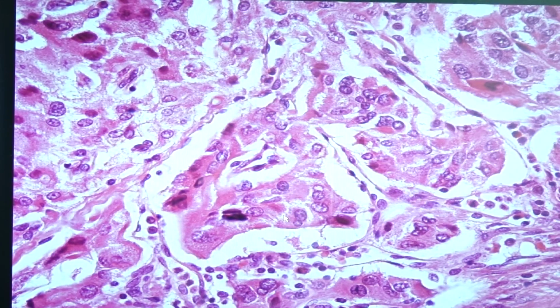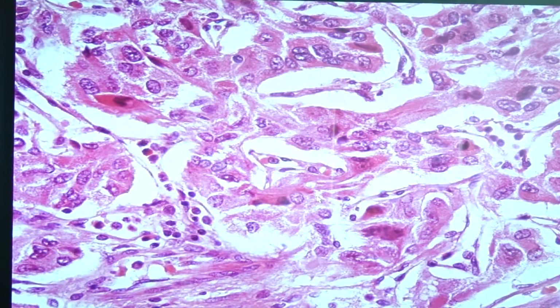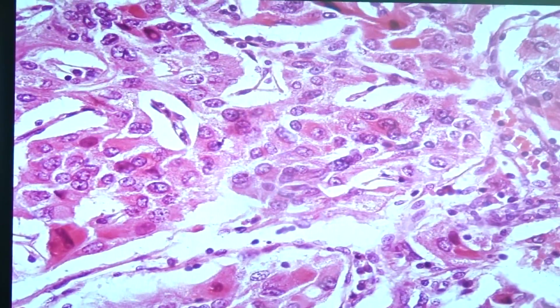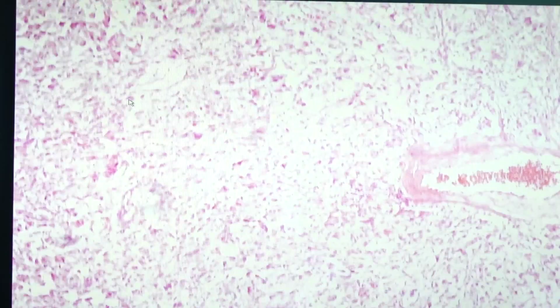They would elaborate catecholamines, that would be epinephrine or norepinephrine. Here you would sometimes see the presence of abnormal nuclear formation or irregularity of the nuclear membrane. So this can still be part of a benign lesion. Okay. So this is Pheochromocytoma.